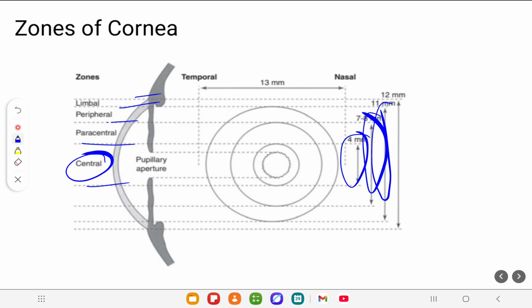In normal corneas, normal cases, keratometry does a good job because keratometry gives the central 2 to 3 mm zone curvature, and that curvature matters if we really think about the central vision. Okay, that's why.